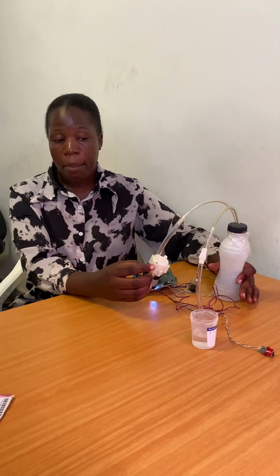So as a team, we decided to come up with a solution for this problem. And we decided to develop a low-cost negative pressure wound therapy device. And this device, we are going to design it using the locally available materials within our country. Like you can see, this is our first prototype.